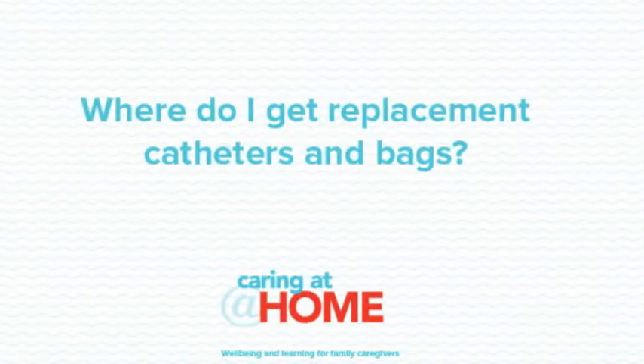At home, night bags may be washed in soapy water, dried and reused for the next evening. These bags may be changed weekly or two-weekly depending on your local area policy. A supply of catheters, leg bags and night bags may be provided by your local district health board or ACC. Always ensure that you have a spare catheter and other supplies in case of unplanned catheter changes.